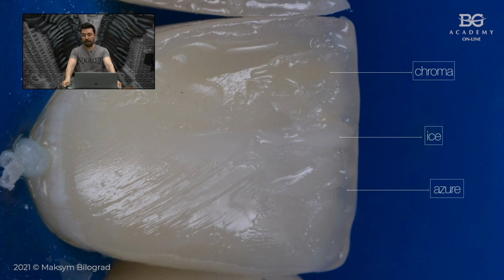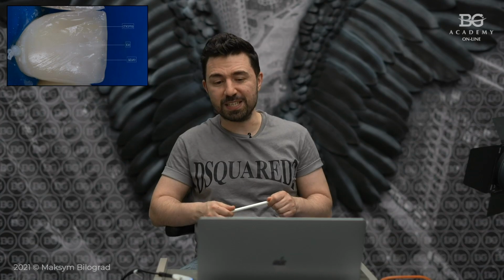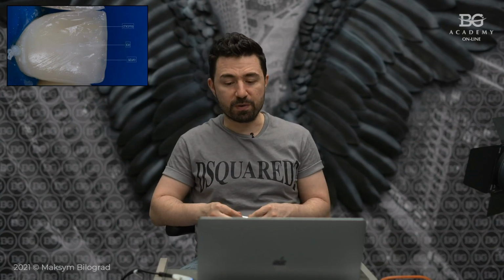And you know what is great? The ice is a white tint, but it is a milky white tint. It's not like an opaque white tint. The azure is a blue tint, but it's not like a high chroma blue tint. It's a little bluish, to create a nice bluish effect on the incisal edge. So if you want to play with that one, you feel yourself as an artist during making your direct restorations. You can use these tints and you'll be very pleased by the quality of the products.